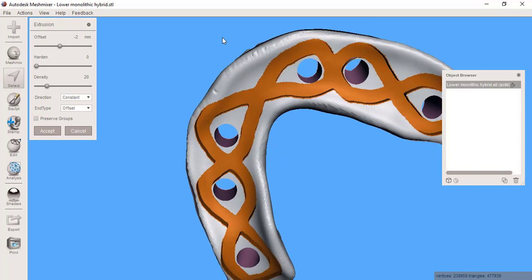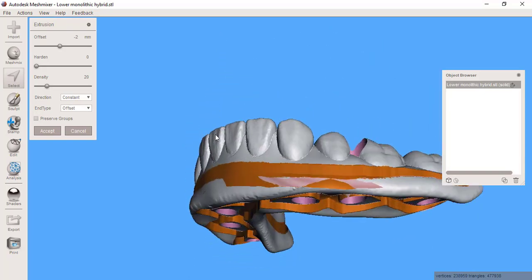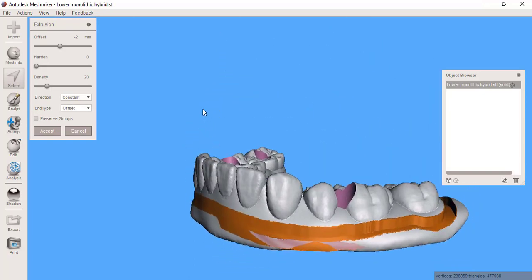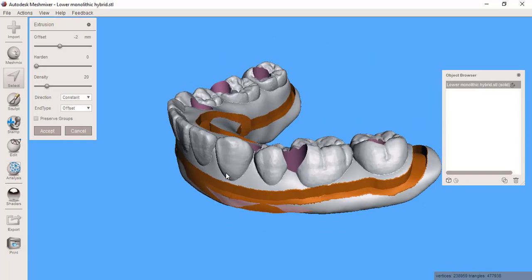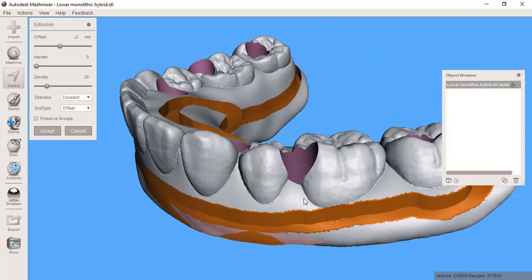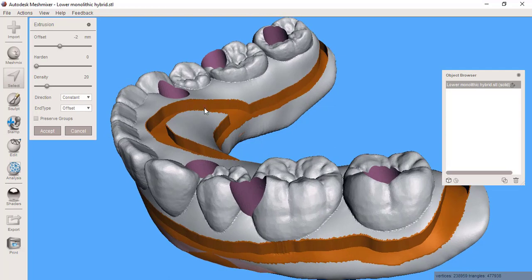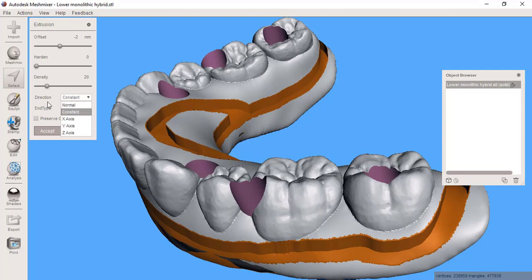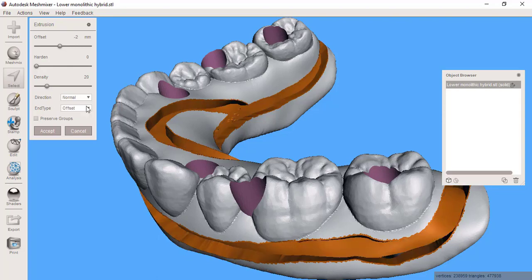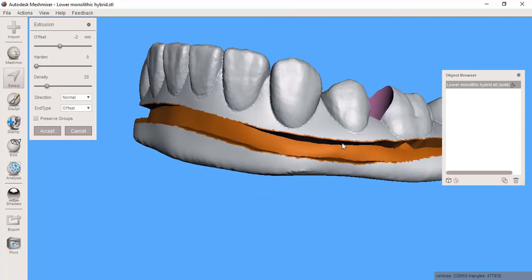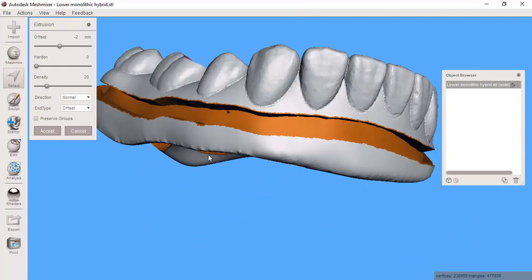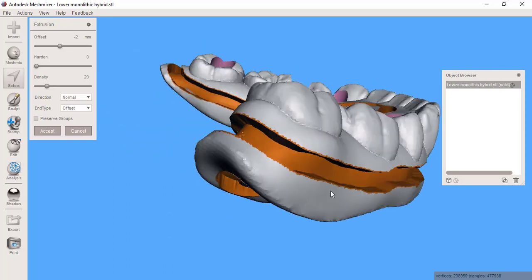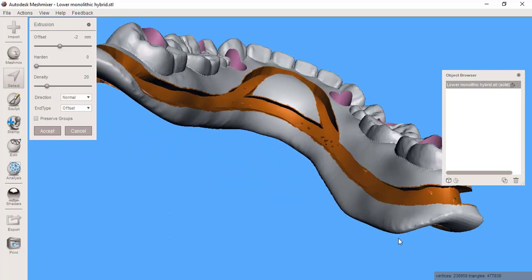I can tell I've gone basically too thin down in this area, but I also notice that it's all doing a channel straight up and down. That's because we're on constant. Let's change the direction to normal. Now that's looking a little bit more like what I want.